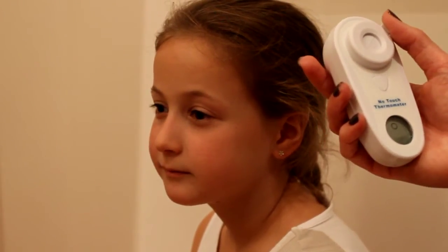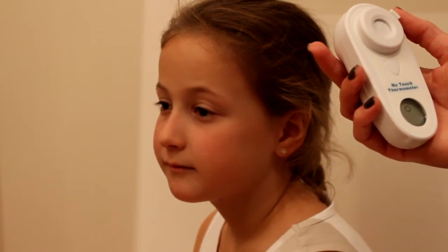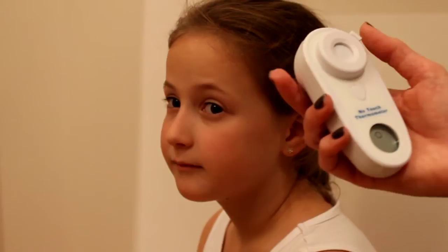Ensure that the thermometer has been in the room, acclimatising to the room temperature for at least 20 minutes prior to use.